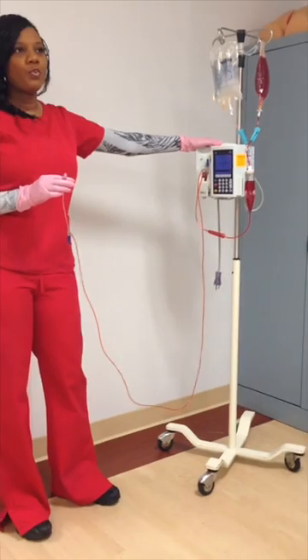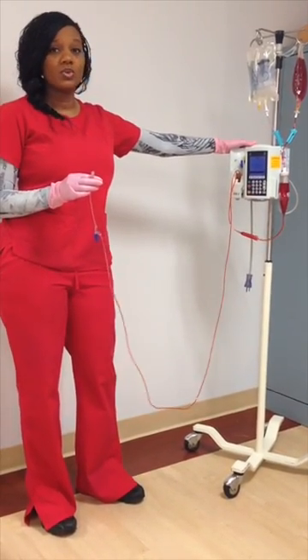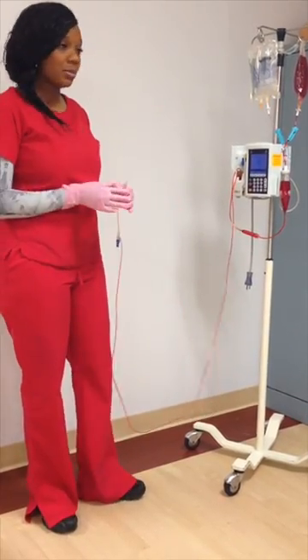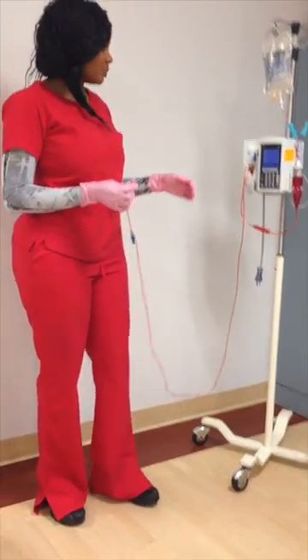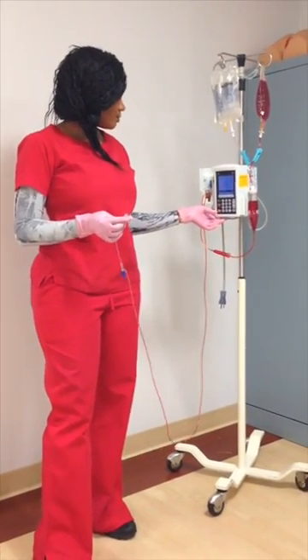When you start your blood transfusion, the protocol here is that you have to have a baseline of vital signs — so you get your blood pressure, your temperature, and your respirations.